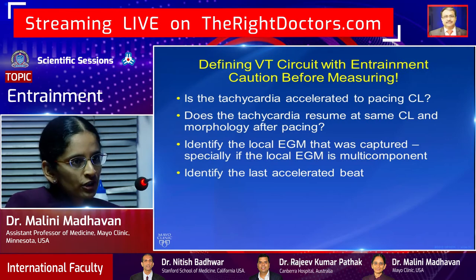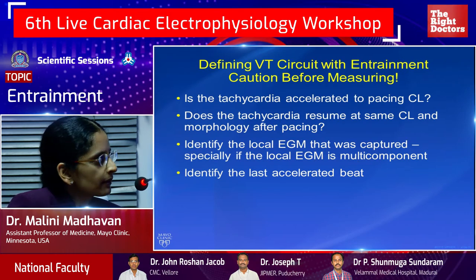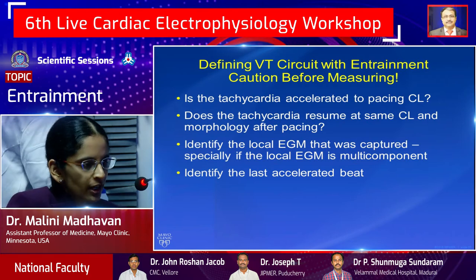Number two, you want to make sure that the same tachycardia and similar cycle length resumed after you stop pacing. So those things are very important before you start measuring anything.